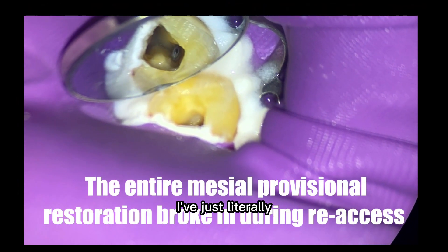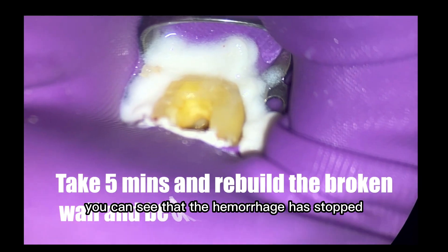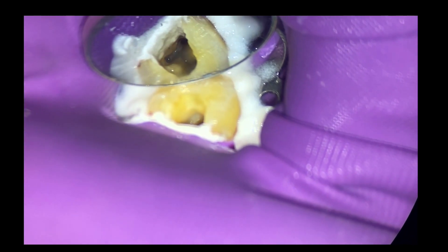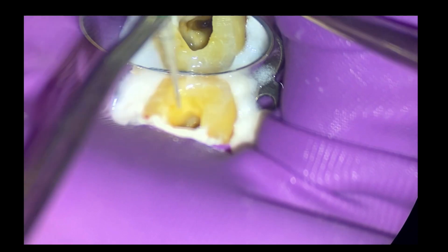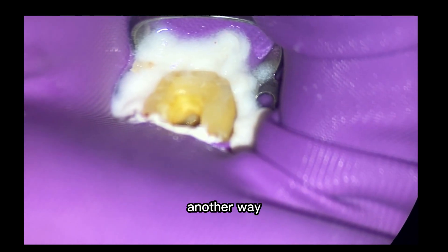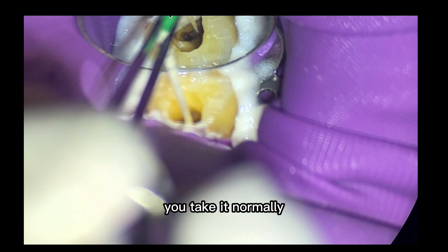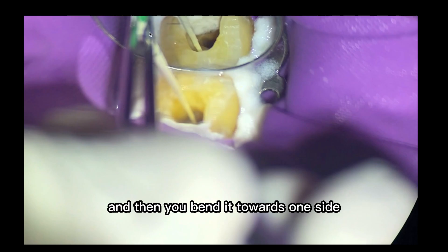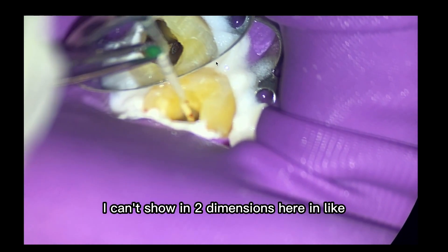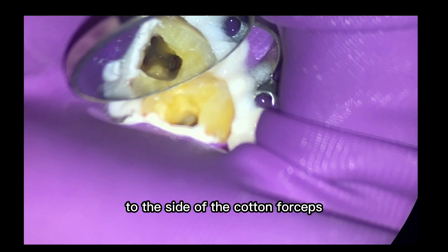Two weeks later. Here we are — two weeks out. I've removed all the restoration; this is just Oraseal all the way around just to get a tight seal. You can see that the hemorrhage has stopped. We're going to take paper points and dry all our canals. Patient's been asymptomatic since the pulpectomy — that's always great news. One technique to mention: you can bend the paper point almost 90 degrees to the side of the cotton forceps, which helps with angulation — very helpful when trying to get into a mandibular molar.